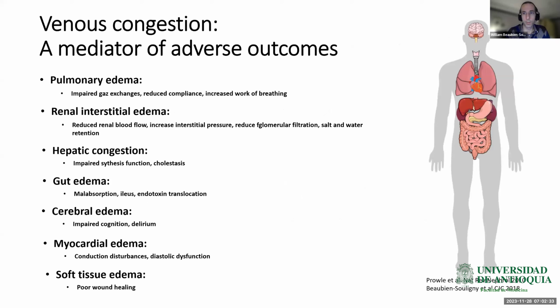This is perhaps unsurprising because we know clinically that venous congestion can occur even if the left ventricular ejection fraction is normal. As you can see in this cohort study, there was a clear relationship between the renal function, the eGFR, and the appearance of these signs.